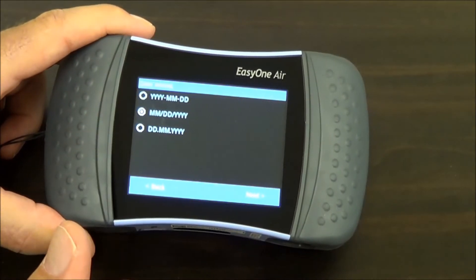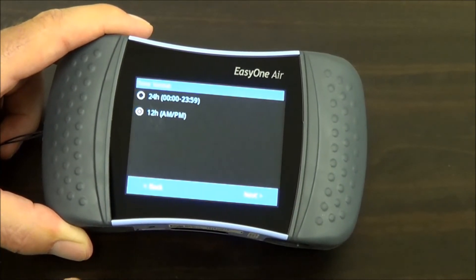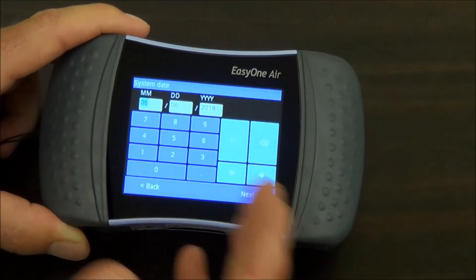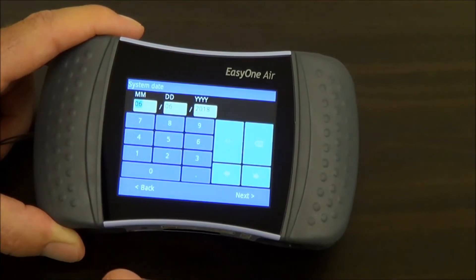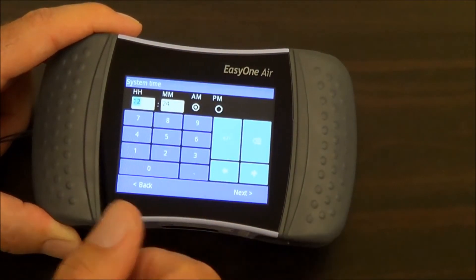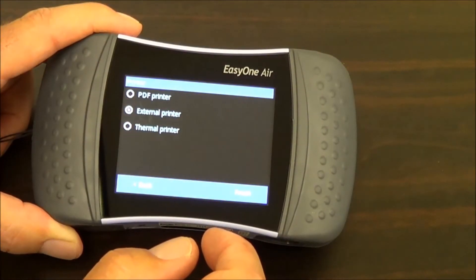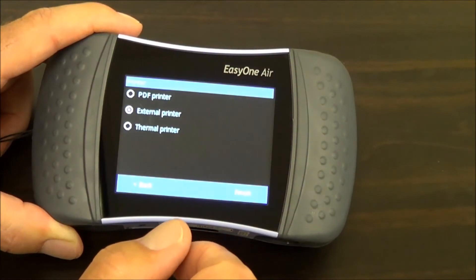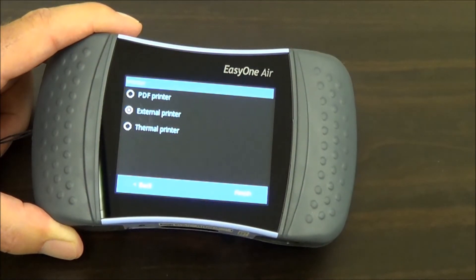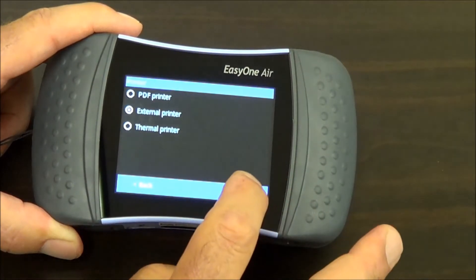You have various date formats — I'm going to leave it set the way it is, which is typical for the US. You can use AM/PM or a military time format. Here you can set the current date and time — it's already set, so I'm going to leave it alone, but you can enter whatever today's date is, and same for the time. We have various ways to print. The default setting is external printer, which is the standard way to print to a standalone printer. We also work with thermal printers, and there's also a way to create PDF reports directly on the device. Hit finish.